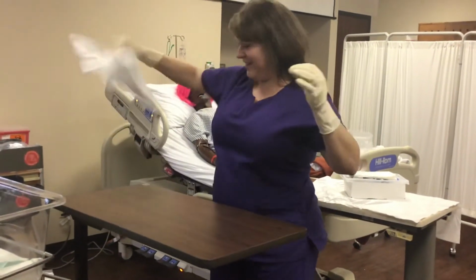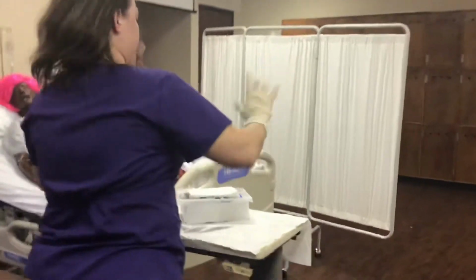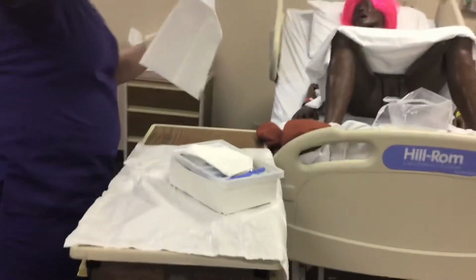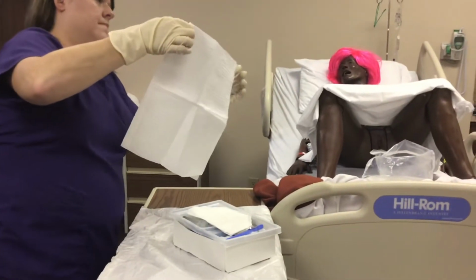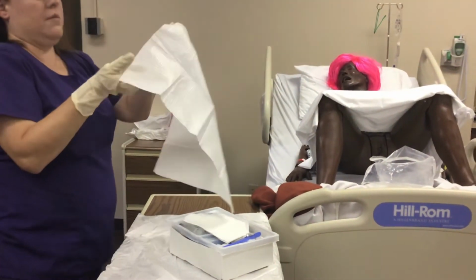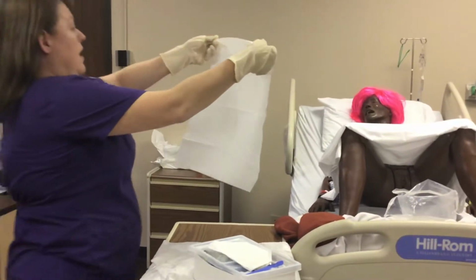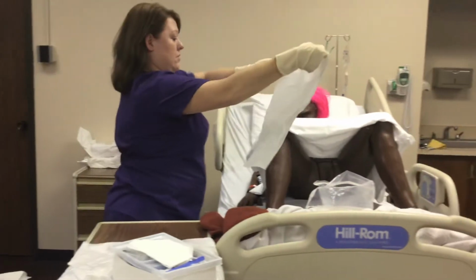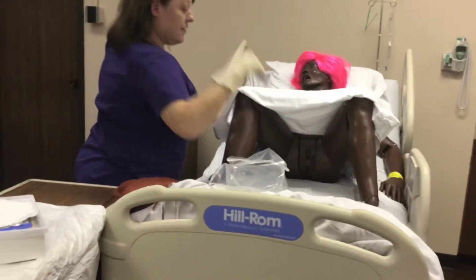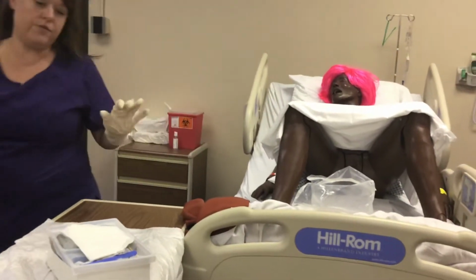I'm going to take this and drop it. All right, now I'm going to take this pad, since I have my sterile gloves on. I'm going to hold it like this along the outside edges again, and I'm going to protect my gloves as I go in, and I'm going to drop it, and then I'm going to adjust it so that I'm still maintaining my sterile field.